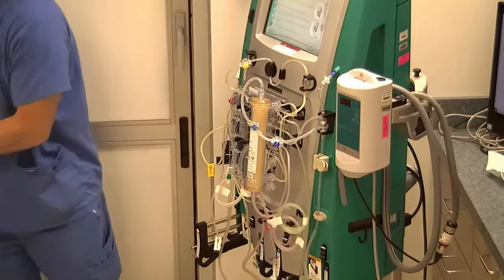Now, typically, I will tell you to follow word by word what the screen has to say on the PrismaFlex. Before we ask, I'm going to deviate a little bit from what the screen has to say when we go to connect our patient. So a little trick here is we are going to clamp all of our Y lines. So we're going to clamp everything here where we had our priming bag. We're going to clamp this little yellow slider clamp, the red access line, and then we're going to go down to our blue slider clamp for the return line and clamp it.